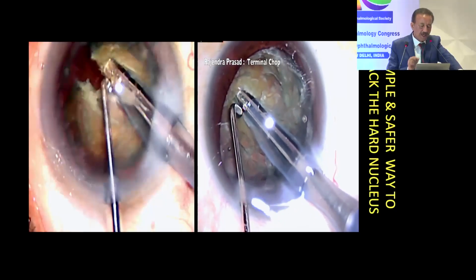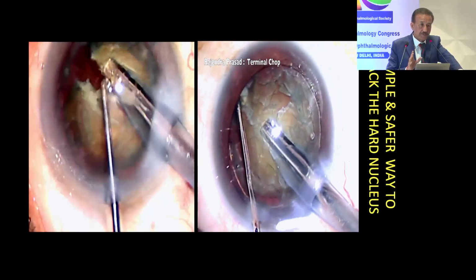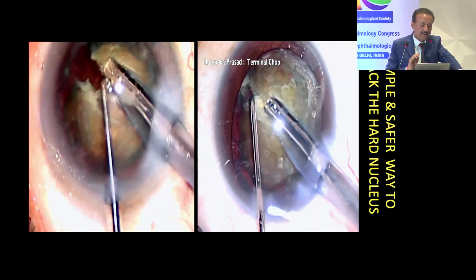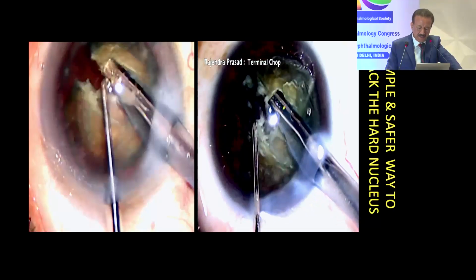This is another case, a very, very hard nucleus. Just hold it. You have to look at the phaco probe where I'm keeping it. I'm not going very deep towards the posterior pole of the nucleus. It's slightly towards the equator. Hold it and then crack it here, and then split it. And when you split it, you get two complete segments.